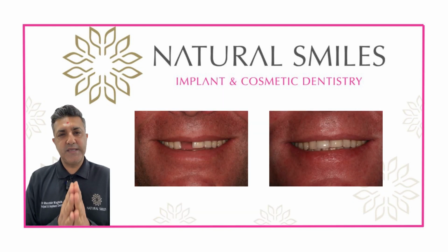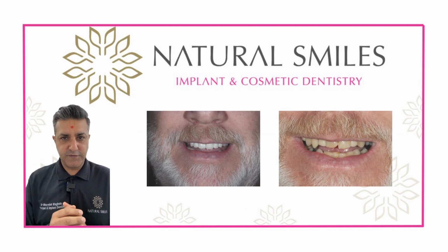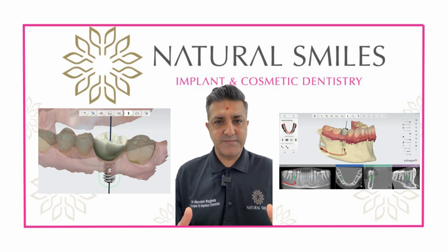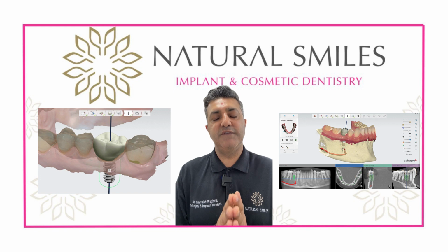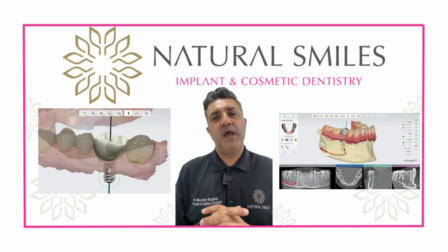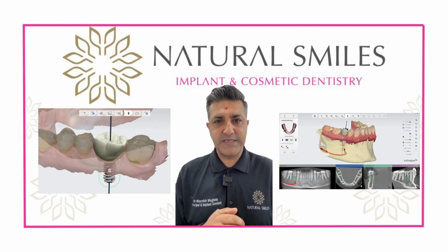So what we can do is we can use dental implants to replace one tooth, a section of teeth, or a whole jaw of teeth, and every patient is treated with a bespoke plan. Pre-planning, we do some x-rays, we take some scans of your teeth, take some photos and confirm what the options available are. And then when we actually start the final planning, we take CT scans to give us a three-dimensional view of the bone that's available. We then have a scan or a 3D mold of your teeth, and we're able to basically superimpose those on top of each other, giving us extreme precision for the final set of teeth that we're making for you.